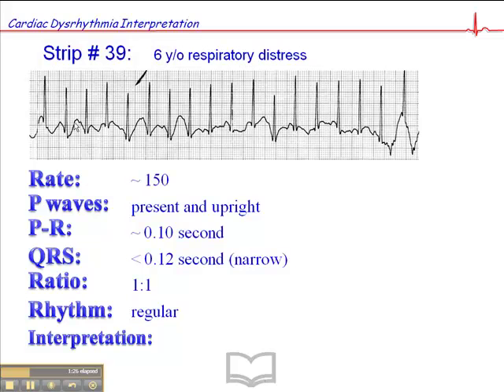The rhythm is regular. And here's the key: when you're having difficulties discerning P-waves, you want to map out the R-to-R interval. In this case, if you were to take a paper from your workbook and map these out, you'd find that the R-to-R interval is consistent throughout. That lends strong support to the fact that this is a sinus tachycardia, in combination with the rate, rather than an SVT or some other kind of dysrhythmia.